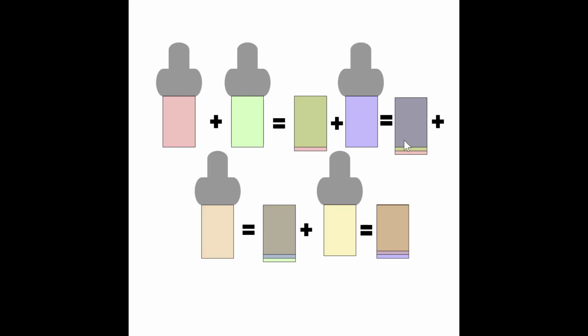Another frame is created, and then it's layered on top of everything. Another frame is created, and depending on how you have your persistence set up, it might drop the oldest image and then layer the newest on top. Again, a frame is created, drops the oldest image, and then layers the new one on top. So we're always creating images from multiple frames prior to the most recent one.